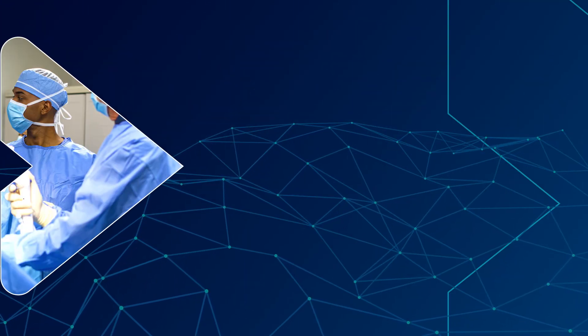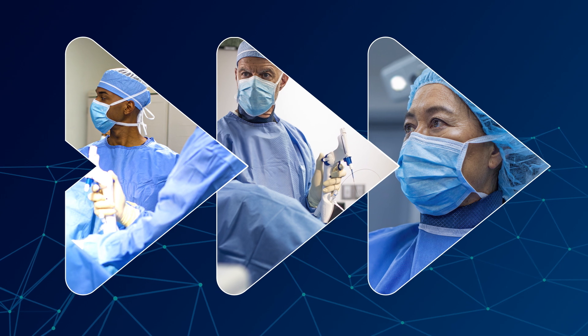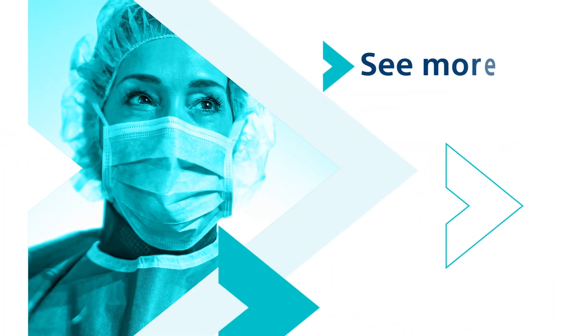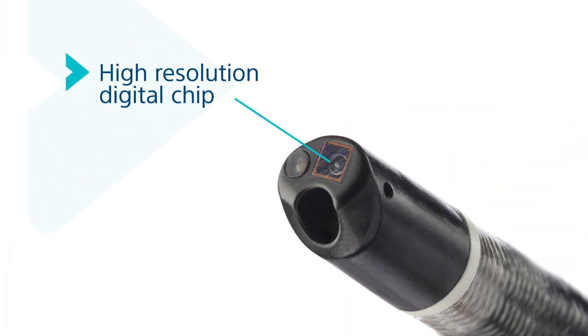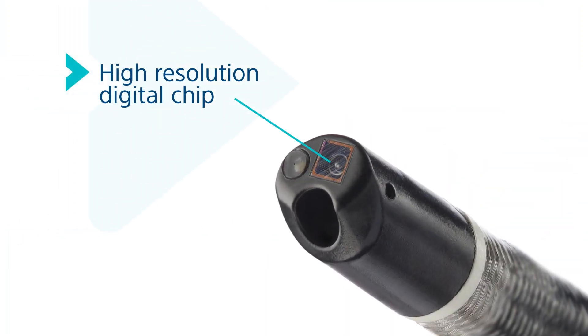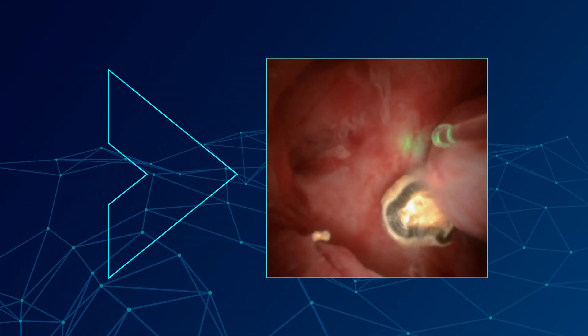The Lithaview Elite ureteroscope builds on the trusted Lithaview system and goes beyond. Next-generation innovations allow you to see more and experience enhanced image quality. With a high-resolution digital chip and proprietary VividView technology image processing, the Lithaview Elite ureteroscope raises the bar on image quality for single-use flexible ureteroscopes.